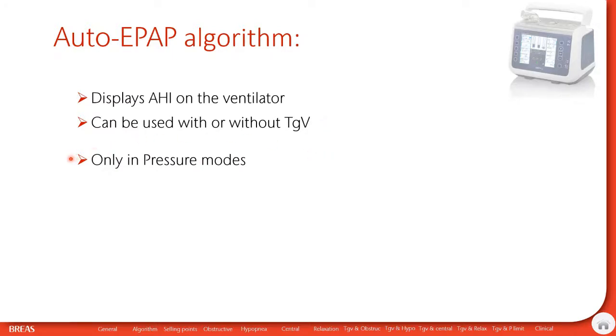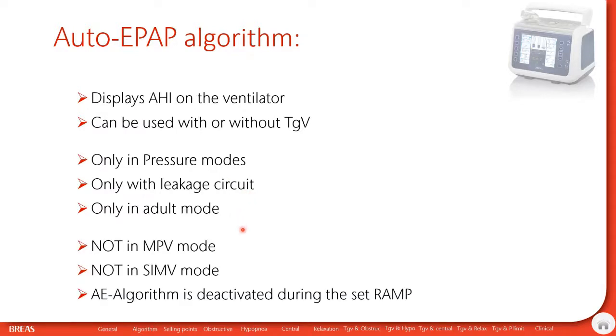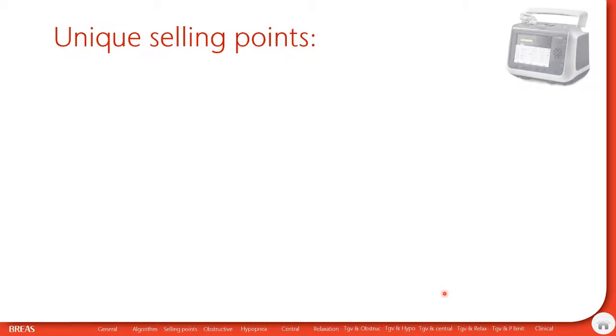Of course, it's only possible to use it in pressure modes, with leak circuit, and in adult mode. It can't be used in MPV mode, it can't be used in SIMV mode, and it's also important to know that the Auto-EPAP algorithm is deactivating during the set ramp.